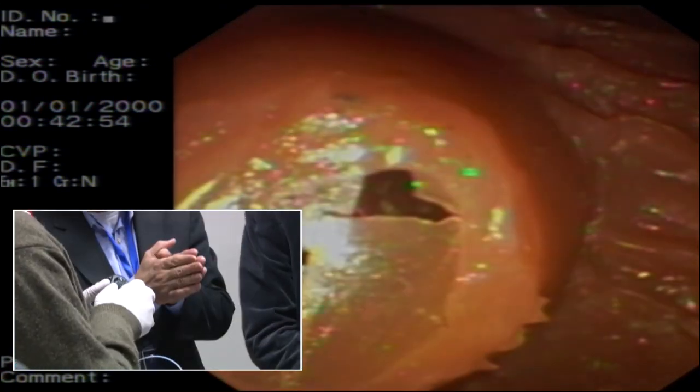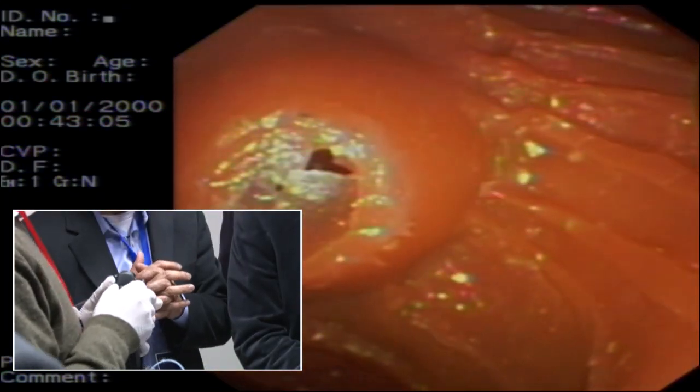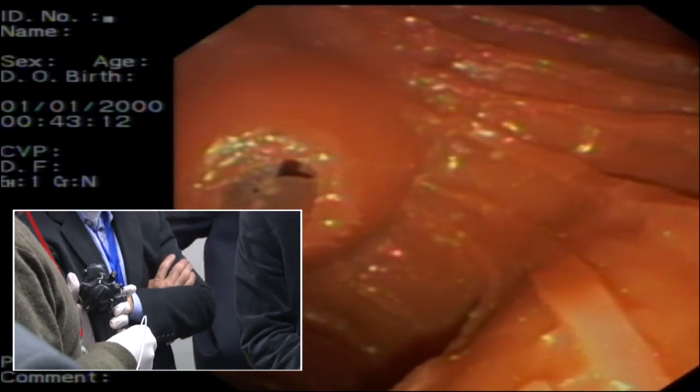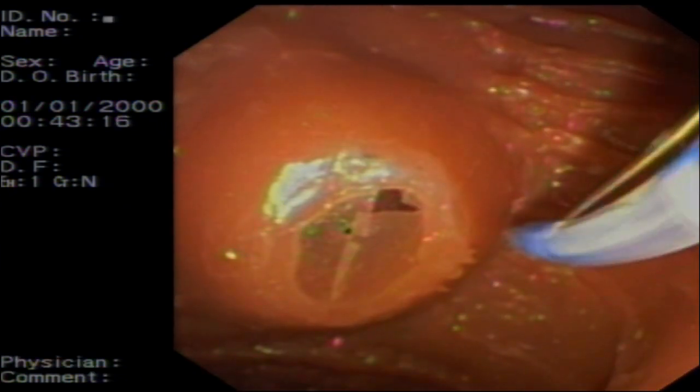अब उसको अपने आप को एडजस्ट करें. हाँ. Yeah, you will get a bit too close. Small way to the other way. You see what it does? Small wheel, you just saw. Yeah. Small wheel is very important. If you're locking it, you're missing this. अच्छा, दूसरा जो है ना, you're a bit far, yeah, that's better.